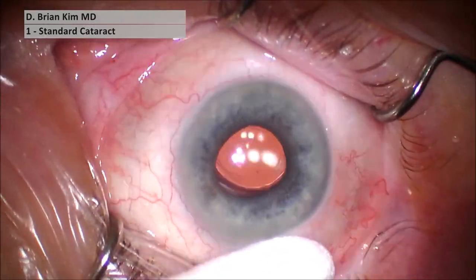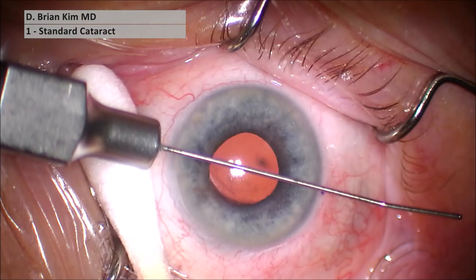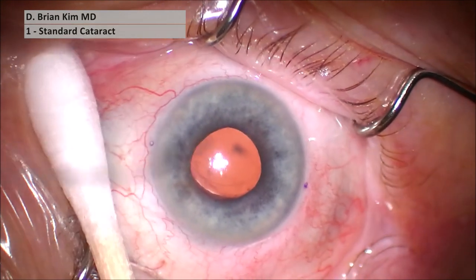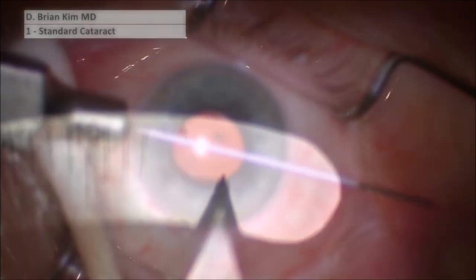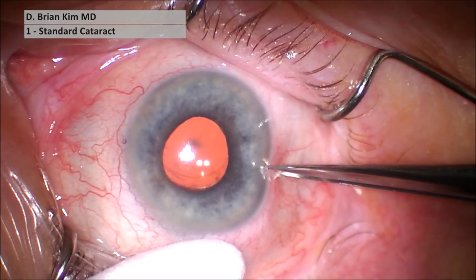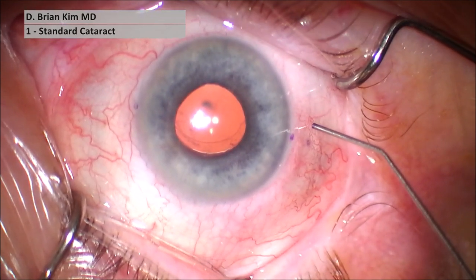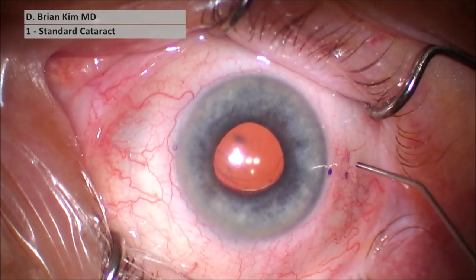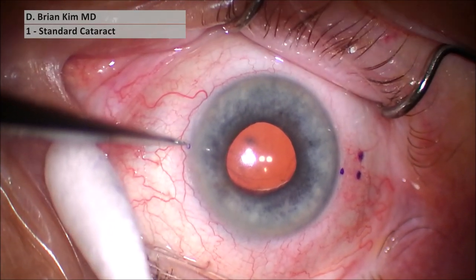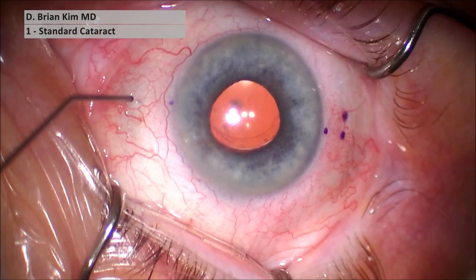You can see how loose this lens is — it's really fairly deep behind the iris plane. I go ahead and mark the limbus, then mark 180 degrees apart using the tip of my 27-gauge cannula, confirming that I'm 180 degrees apart. Then I go ahead two and a half millimeters posterior to the limbus, marking radially, indenting the sclera, and marking again with the tip of the cannula. This gives a really nice discrete mark, and then two millimeters adjacent to this mark. Using the caliper: two and a half millimeters. On the other side, doing the same thing — making a radial indentation from the limbal mark, inking the tip of the cannula, marking that mark, and then two millimeters adjacent.